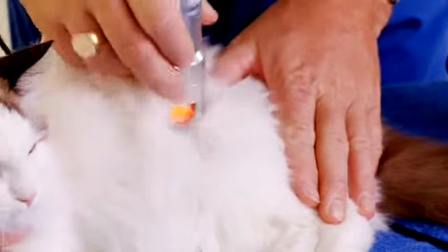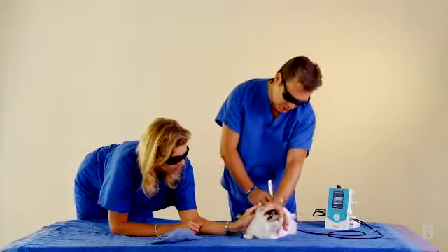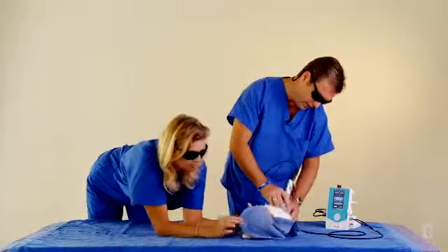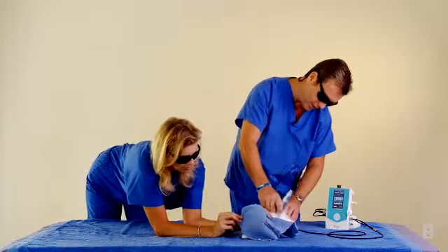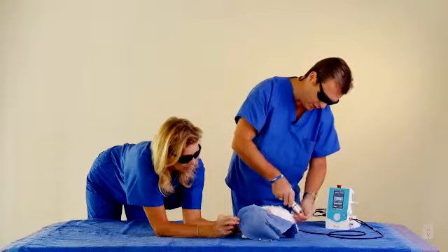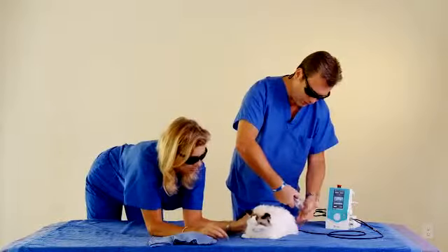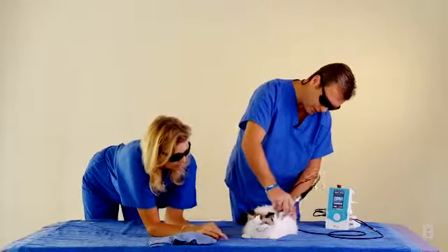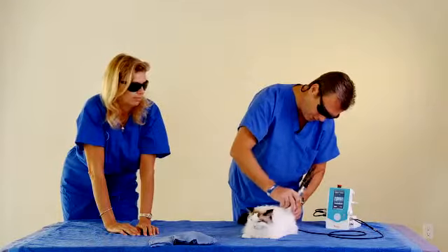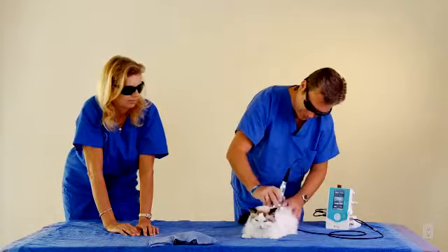And for demonstration purposes, if the cat had a back issue, we could just do this. If you were by yourself, you could hold the cat, protect its eyes, and work your way up and down the vertebrae. You can also use a painting technique. You can also turn your spot size down to whatever you think is best for your clinical application. And right now I think our patient's kind of getting used to the idea that she's just kind of being petted with this aluminum thing.